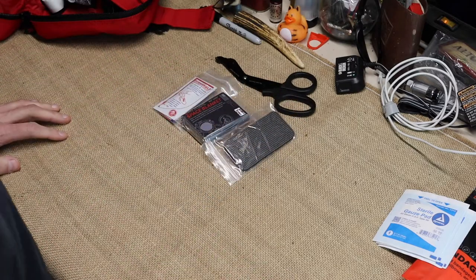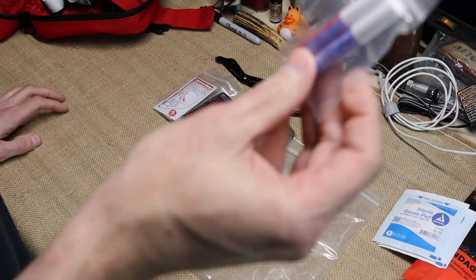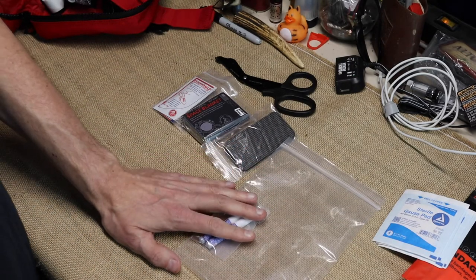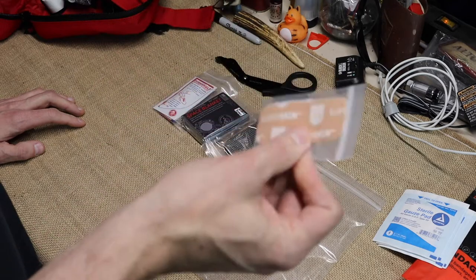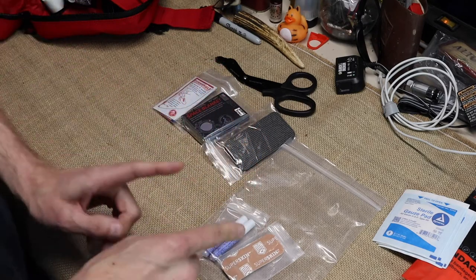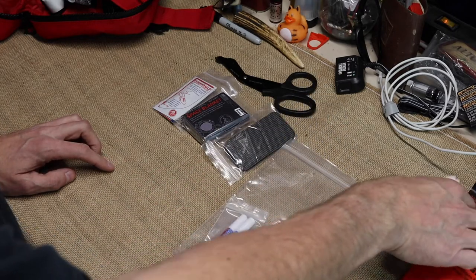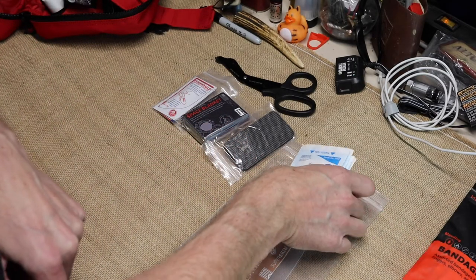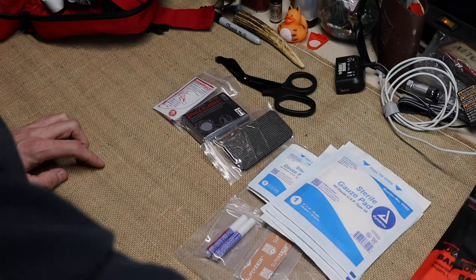There's another kit inside this one, in a separate bag. First off there's liquid skin — I've never used it but everything I've read says it's pretty cool. They have mimetic super skin for blisters, which I'm actually fixing to order for a few things. Then you have different styles of gauze: two-by-two and four-by-four pads.